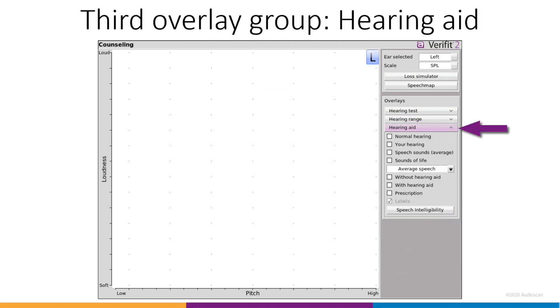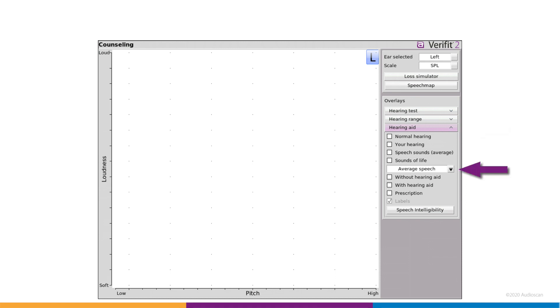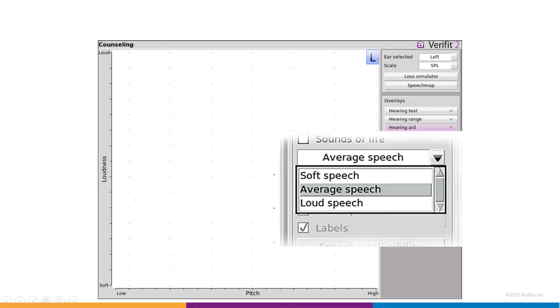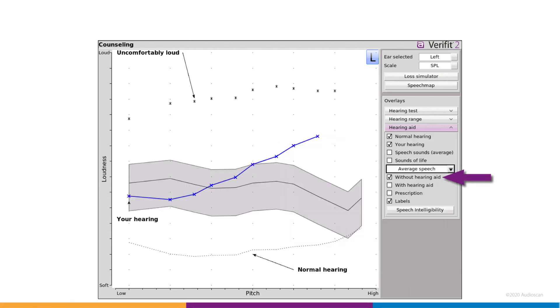The third group, hearing aid, is where the speech spectra come in. There's a level selector which allows you to select from the standard speech test levels. For each level, a predicted unaided spectrum can be displayed.